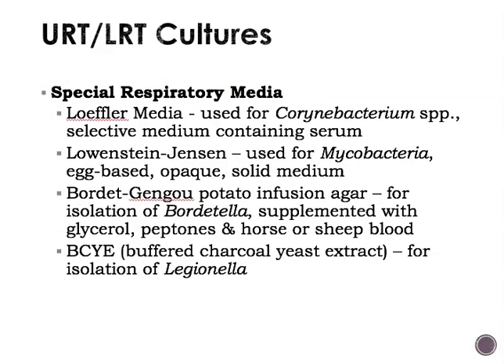Okay, some special types of respiratory media that could be used. Most respiratory cultures would routinely only be cultured on your blood agar plate, your MacConkey or your EMB plate, and your chocolate plate, and usually that's sufficient. But if there are other specific organisms that the doctor may suspect, specialty media might be necessary.